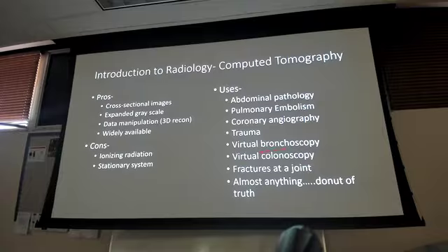Fractures at any joint. So if you notice a lot of those CTs we were doing, they were intra-articular fractures. Most any joint fracture requires a surgery, so that's why those are gonna get a CT, so the ortho folks know exactly what to do, all right?